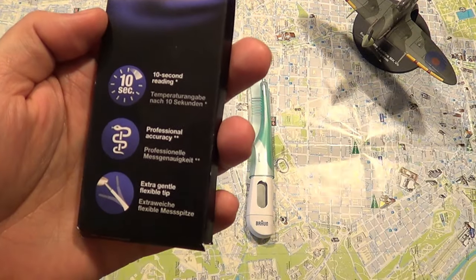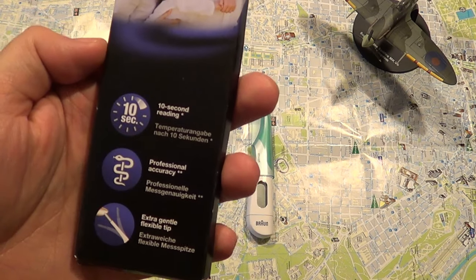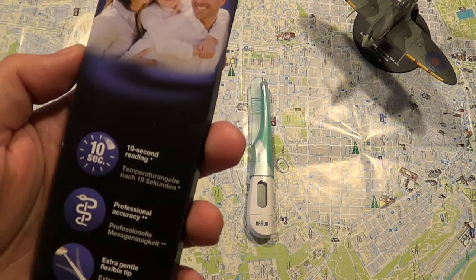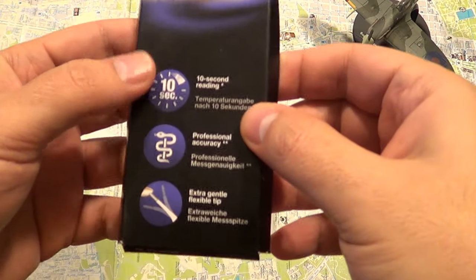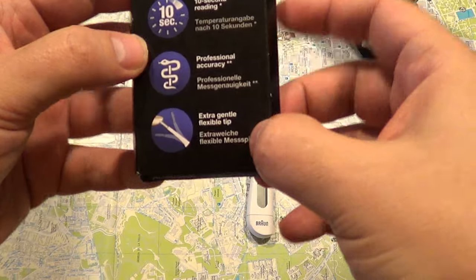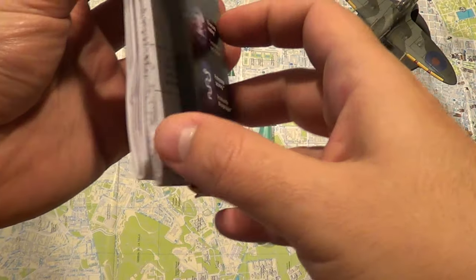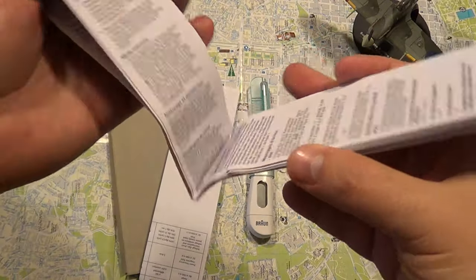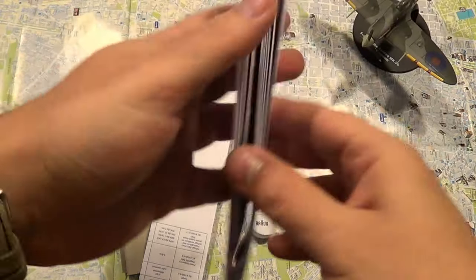It says high speed, it says it has a 10-second reading which is very important for kids, because you want to take the temperature from a kid and you don't have the time that you have with an adult. It says professional accuracy and it's a bit flexible, as you can see. There are some instructions and manuals in various languages.